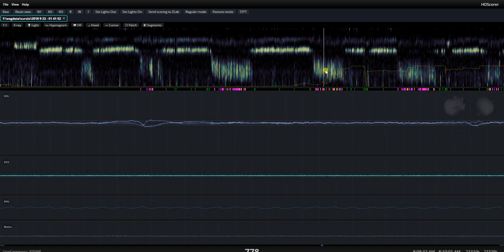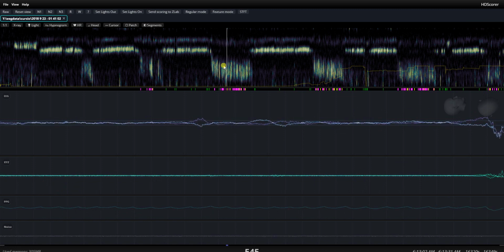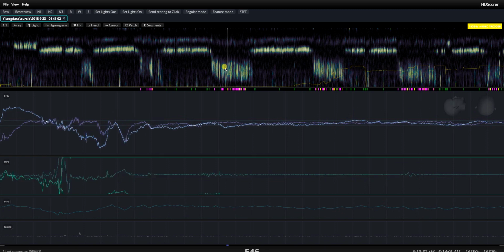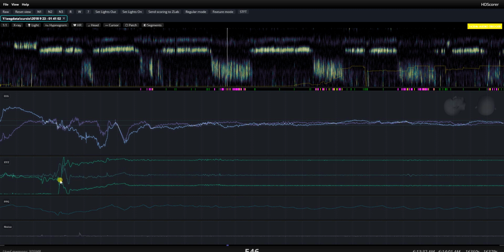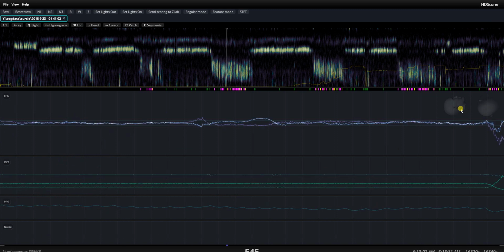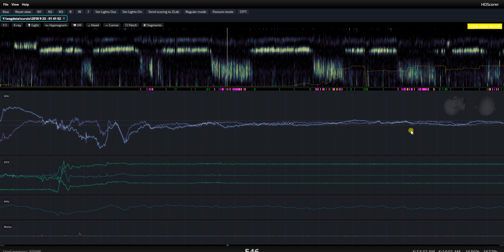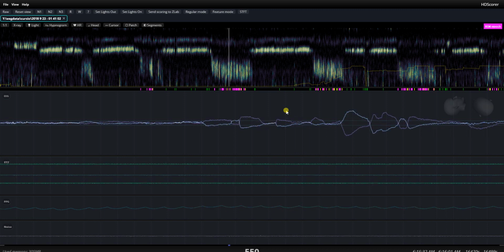So the idea here is to give an audio stimulation, not during common REM sleep, in which, as we know, the auditory pathways are blocked, but during periods of an actual arousal, when, for example, here you can see from the order of the accelerometer traces that there was a change in position. You can also see it with the head here, although I think the degree of transparency is a little bit excessive, but you can see this was a change in position all the way from facing to the right to facing to the left. So this is an ideal stimulation point where you're probably awake, but you're going to fall back asleep really easily and quickly, and you are in a long REM sleep chunk.